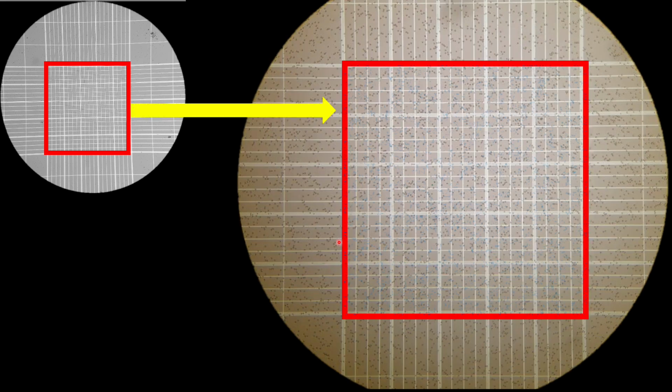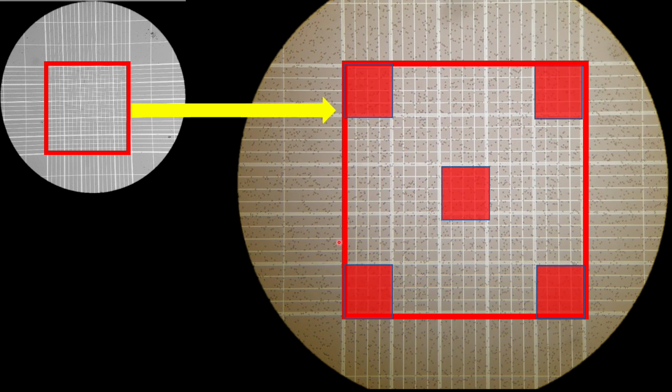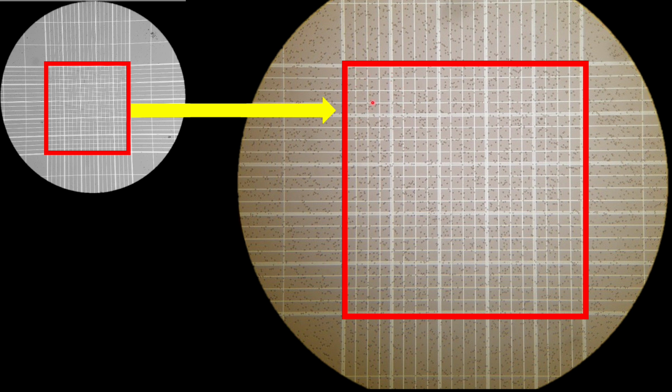Guys, ito pa lang. Ito pa lang ang na-count natin. Isa pa lang. So, 22 yun. Okay? I-count mo pa dito, i-count mo ito, i-count mo ito, i-count mo ito. And then, you add all of them. Tapos, pag na-add mo na siya, ang gagawin mo, sa kabilang counting chamber ka na naman.